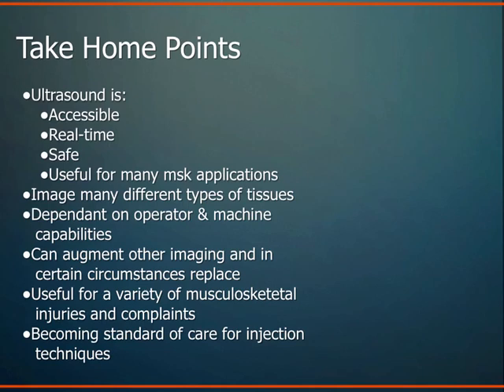So, take-home points for MSK ultrasound. A lot of benefits for this modality, especially in the world of MSK and the world of sports medicine: real-time accessibility, very safe, and a lot of applications for MSK imaging. You can image all kinds of different tissues, and it's important to keep in mind, though, as you're imaging those different tissues and you're looking for pathology, that you have to realize not only your personal limitations, but also the limitations of the ultrasound machine, as you get more and more training and more comfortable with the modality.